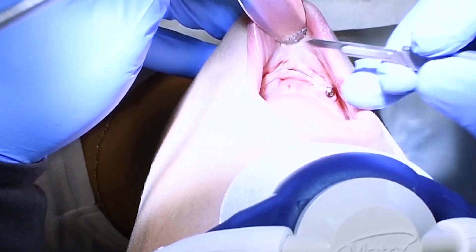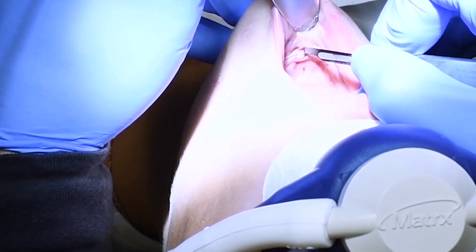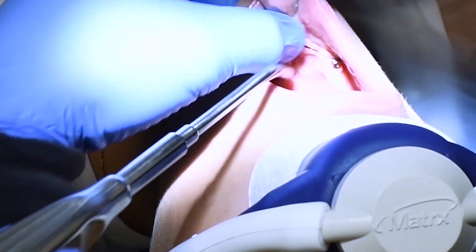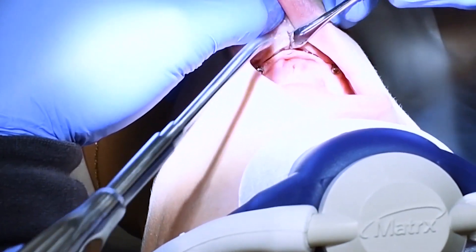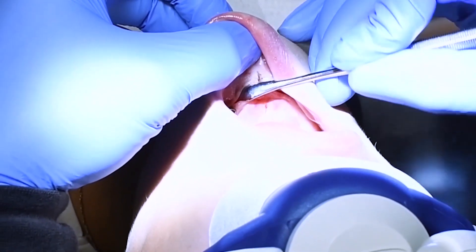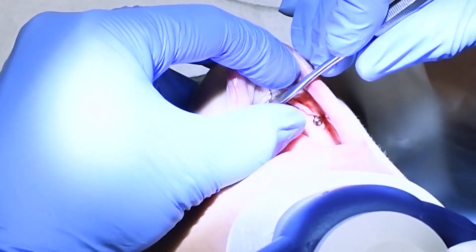I'm raising a flap here using a periosteal elevator just to elevate the soft tissue off of bone to expose the bone.